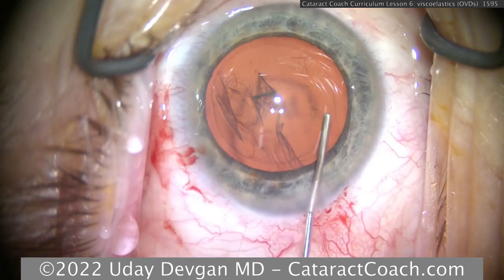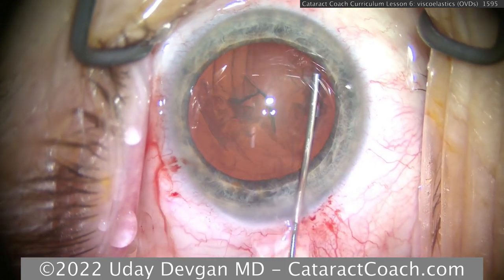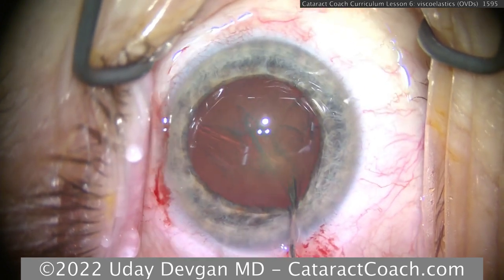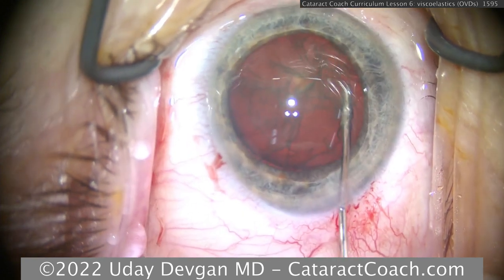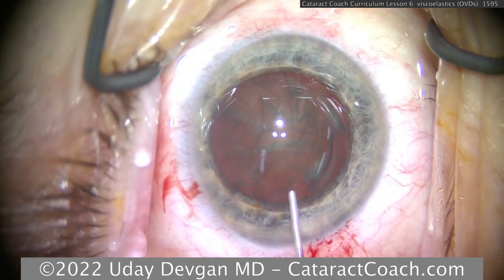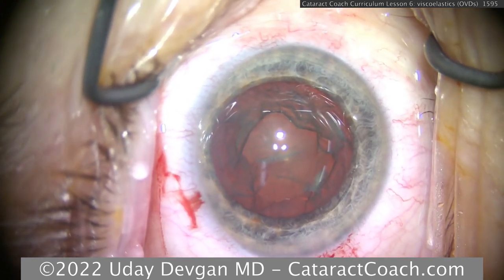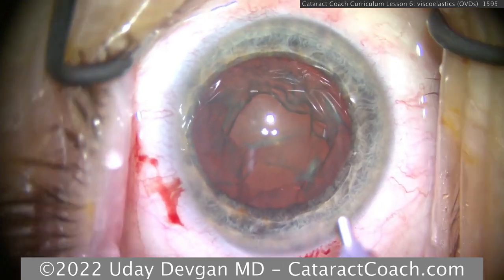Now, when we do our hydrodissection, we're certainly going to lose viscoelastic. There, it keeps burping out the incision. Cohesive will burp out a lot easier than dispersive. So the viscoelastic that came out is probably mostly the cohesive one. There's the nucleus that's rotating fine. So let's refill and recoat the endothelium centrally with that dispersive, just to be sure. We want to protect that cornea during phacoemulsification.